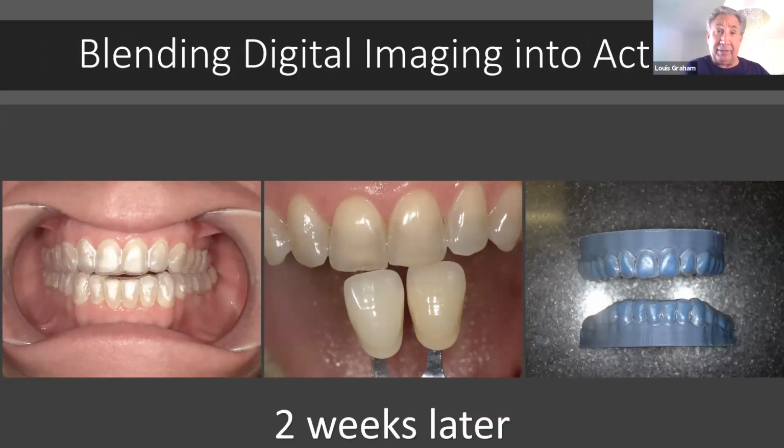So with iTero time lapse, if we bring a patient in every year, at the recall appointment one year later, we can evaluate time lapse. Is there more recession? Is there more tooth wear? Is there tooth movement? I can look at all these things and, through the data, show a patient if there are any changes. In this case, the patient wanted to bleach their teeth. Now I've already captured where they are. It's a great learning tool for the patient.